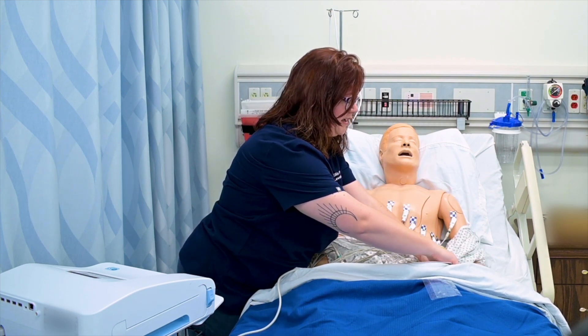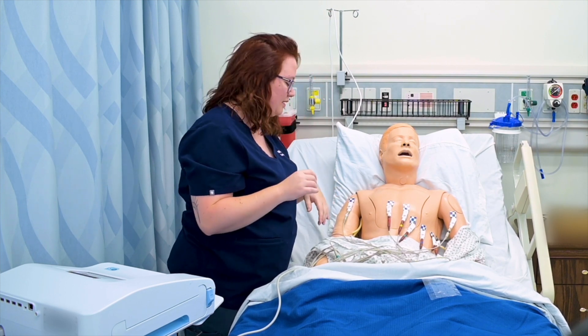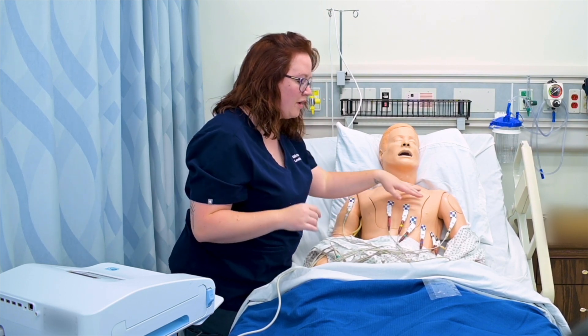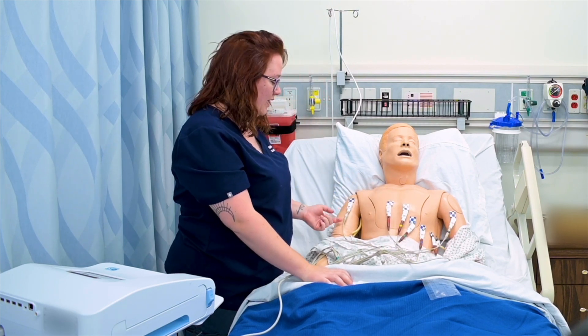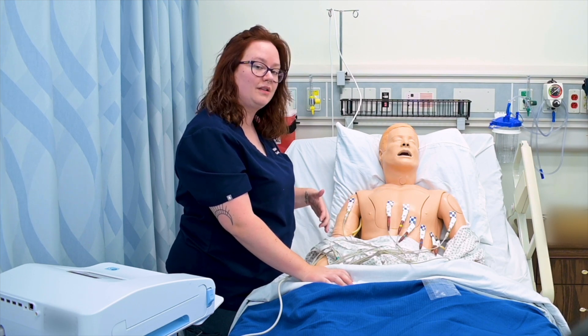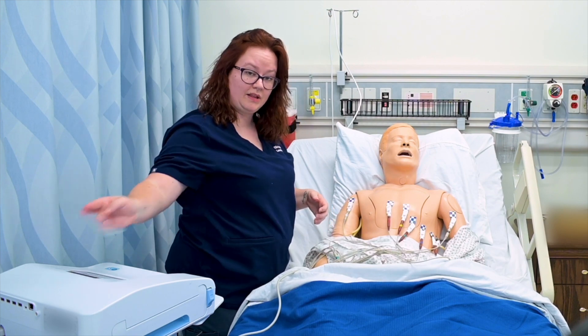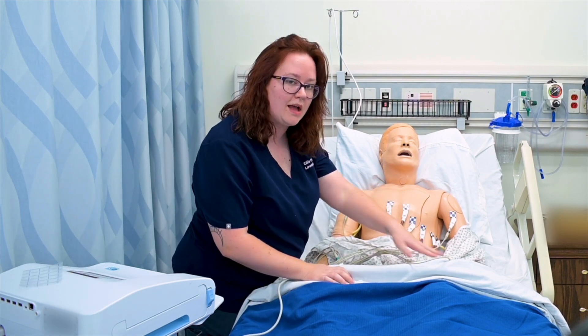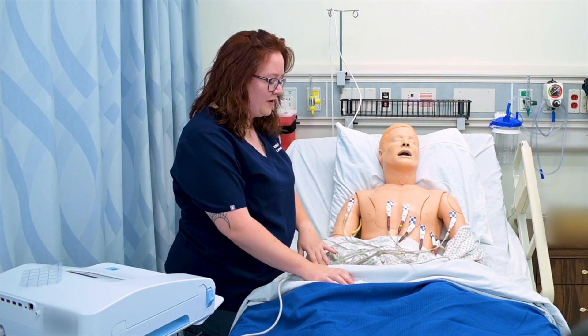The arm and leg electrodes are always the same color. We like to say the phrase 'smoke over fire,' so I've got black over red, and 'air over ground' or white over green. Even if they weren't labeled — and almost all facilities have labeled them now — I have labels like L-A and L-L for left arm and left leg. It's smoke over fire and air over ground.